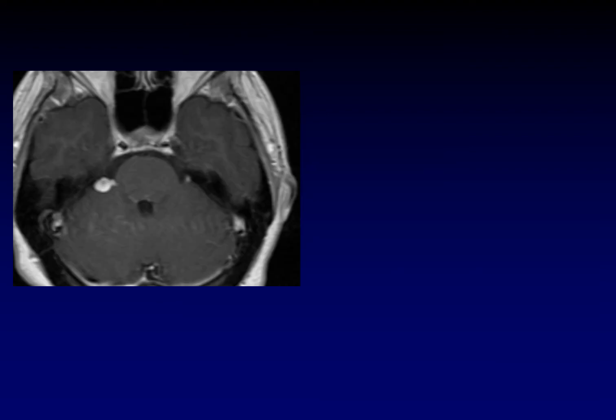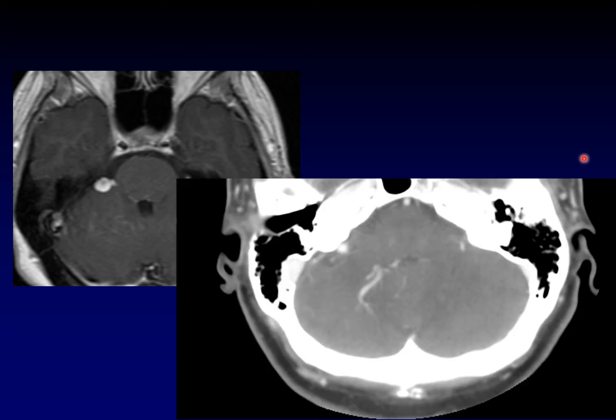At first glance, this lesion looks a lot like that lipoma from a few slides ago. It's rounded, a little bit lobular in the cerebellopontine angle cistern. I will tell you though that this is the true enhancement and not just intrinsic T1 signal. So what other lesion might be sitting out there? Well, if you look at a corresponding CT angiogram, you can see the classic Medusa head appearance of a developmental venous anomaly. Let's follow that out.